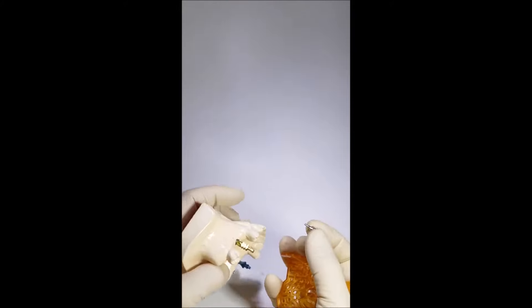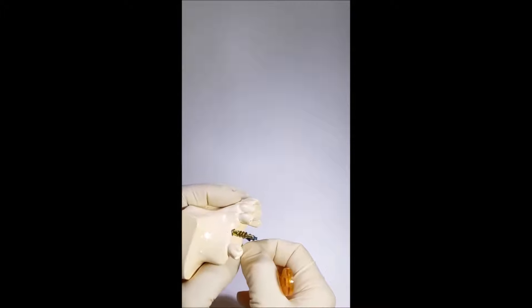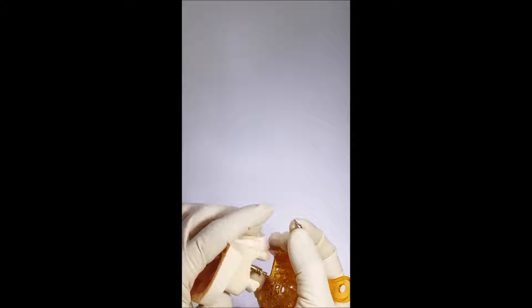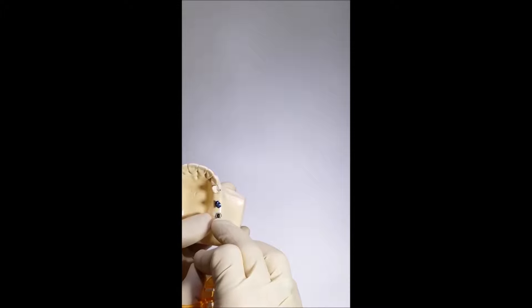In order to provide a denser fixation of the transfer in the implant, it is necessary to separate the clips a bit. However, this should be done very carefully in order to avoid damage to the inner part of the implant.